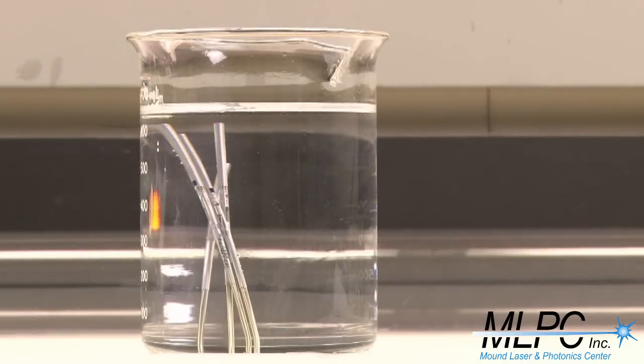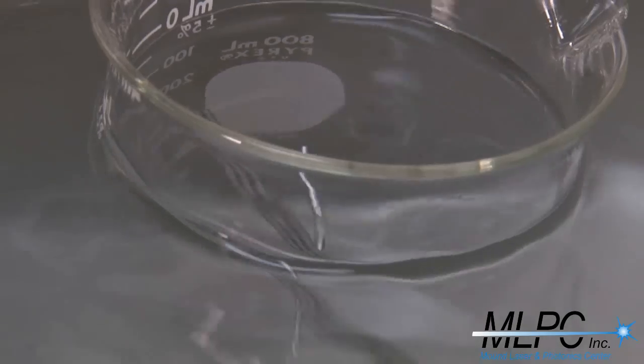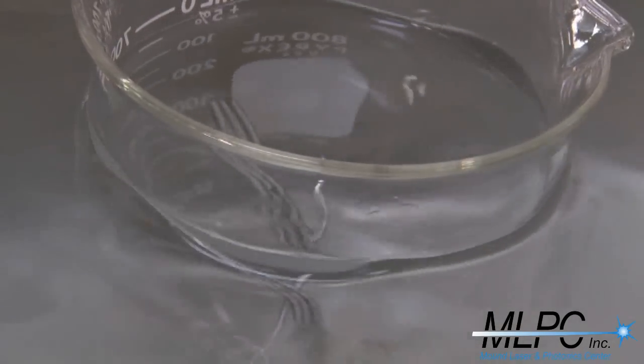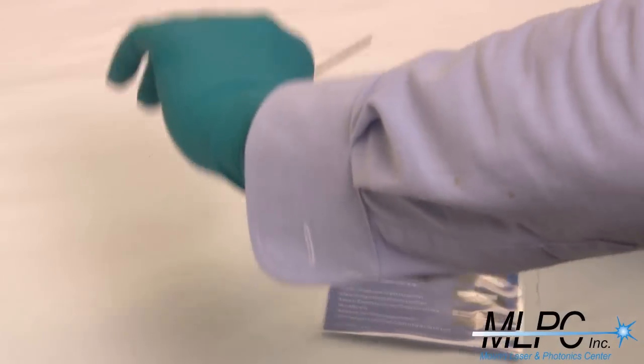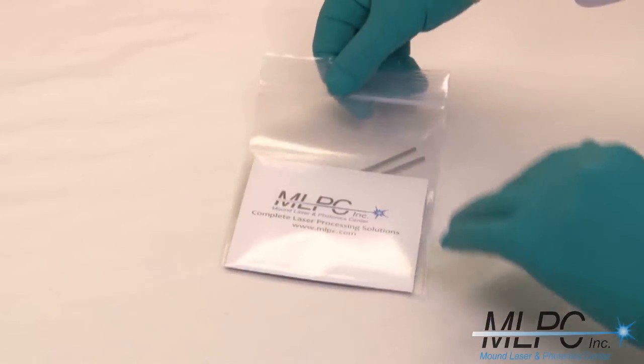After being laser marked, the parts are taken to the post processing lab. In this lab, the parts are ultrasonically cleaned to remove any leftover oxide. The parts are then inspected and bagged and are complete.